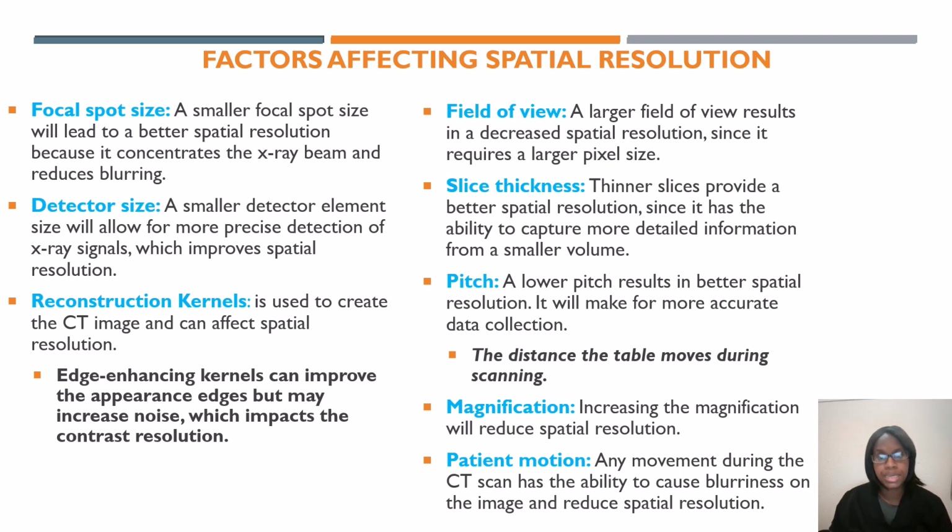And then you have your pitch. A lower pitch results in better spatial resolution. It will make for more accurate data collection. Pitch is the distance the table moves during the scanning.